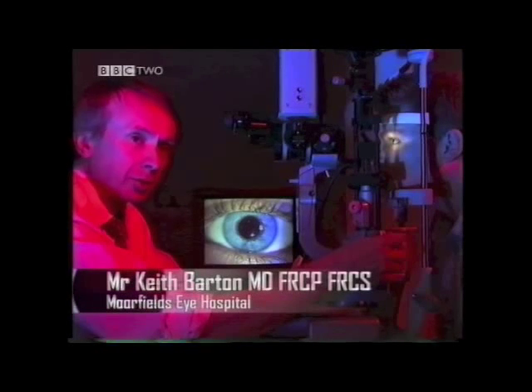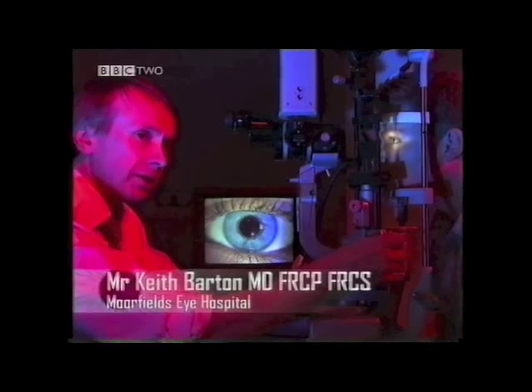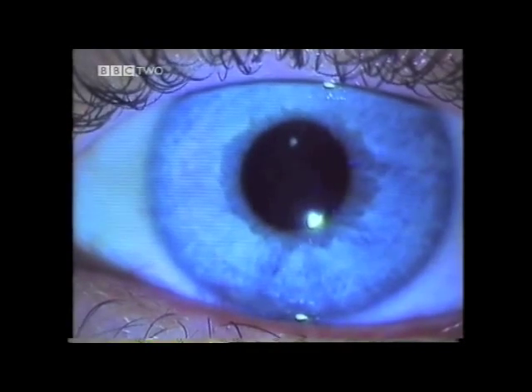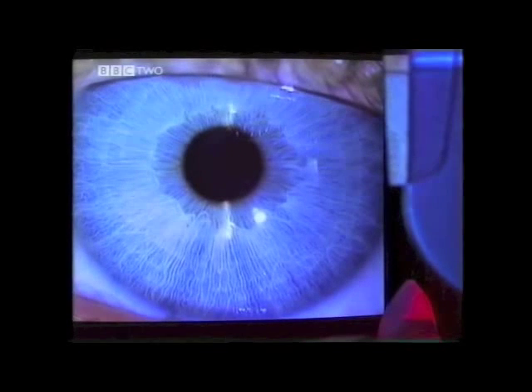I'm using a slit lamp to examine Tony's eye. A slit lamp is a high-powered microscope that allows us to see the eye up close, as in this picture on the TV screen here. The first thing we see when we look into the eye is the cornea — a clear window that allows light to get inside the eye. It focuses most of the light, and most of the focusing power of the eye actually comes from the cornea.